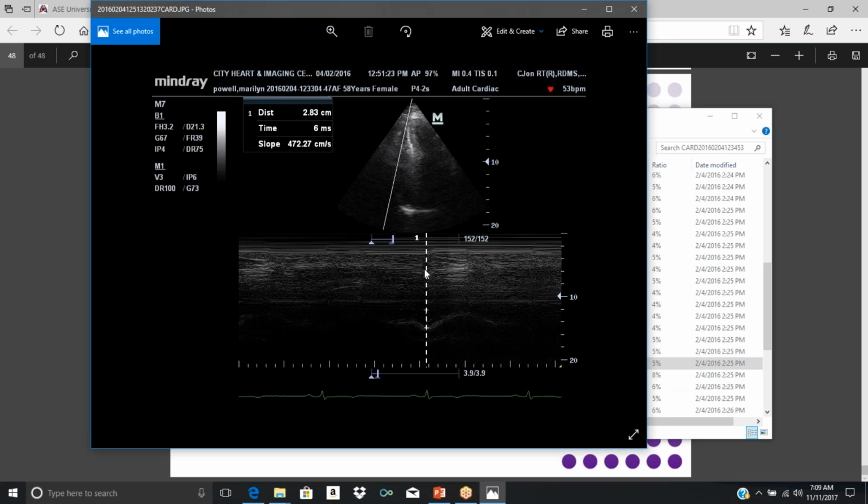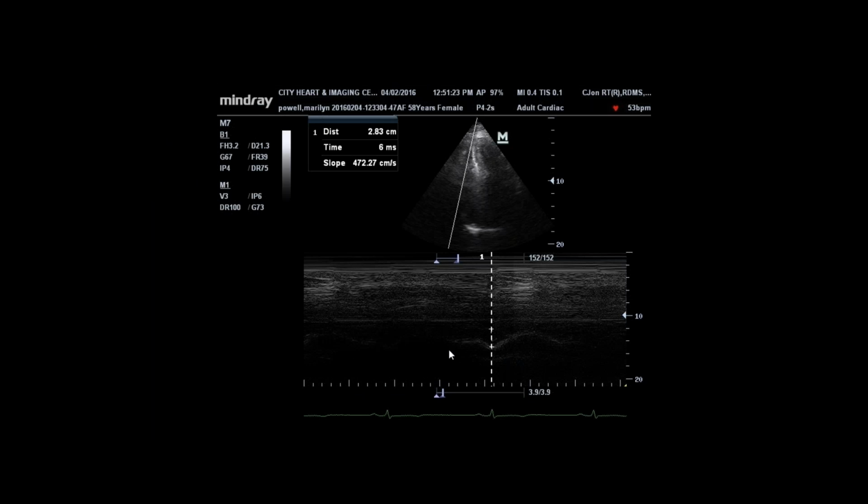Okay, this is a form of a tissue Doppler. As a matter of fact, this is not really a Doppler. This is an M mode measurement. You have not done M mode, but I can still mention it. Your two-dimensional echo is on top right here.